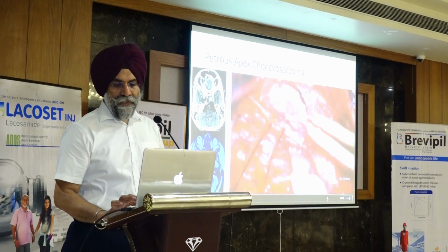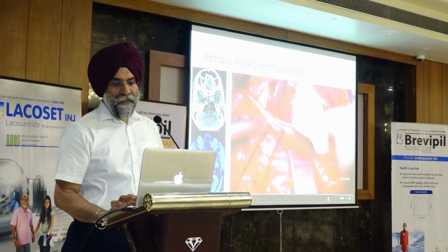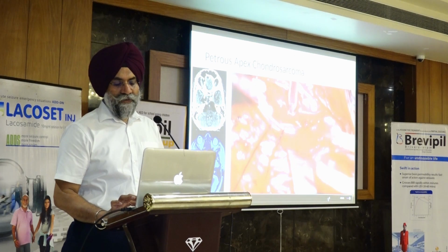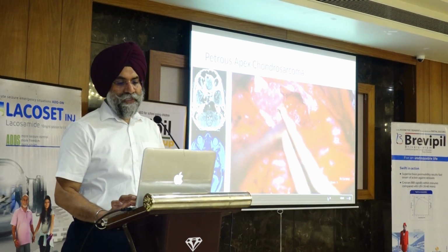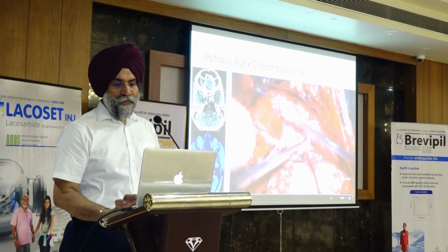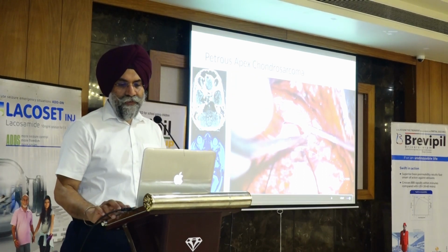So this tumor is completely out. This is venous blood again, and because one of the spots with the lateral wall of cavernous sinus is disrupted, just again controlling with the gel foam. So that's all. Once it is controlled, just put a little bit of glue to support that, and our surgery is over.